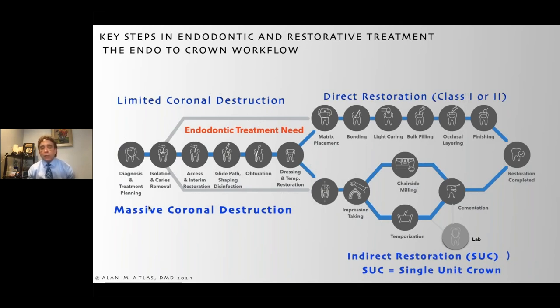The bottom line is I'm going to tell you the tipping point in this procedure is the core and post. And we're going to see this tipping point is going to change and transform how we do endodontic treatment, restorative treatment, and how we're going to improve the restorative outcomes.